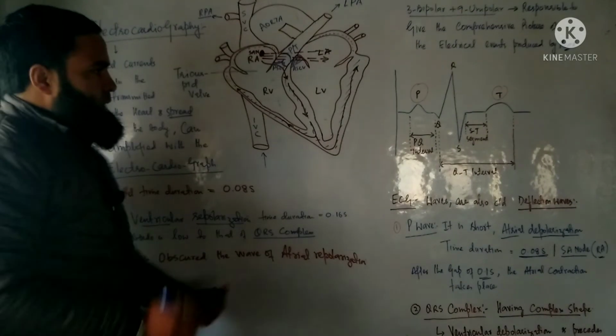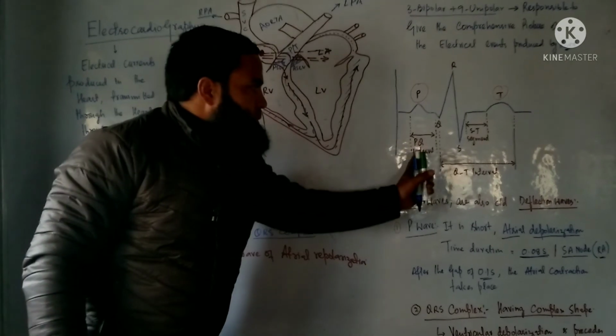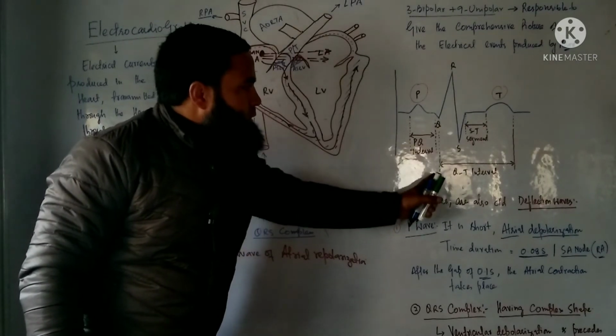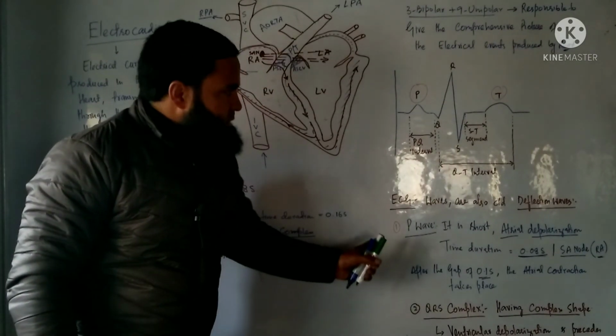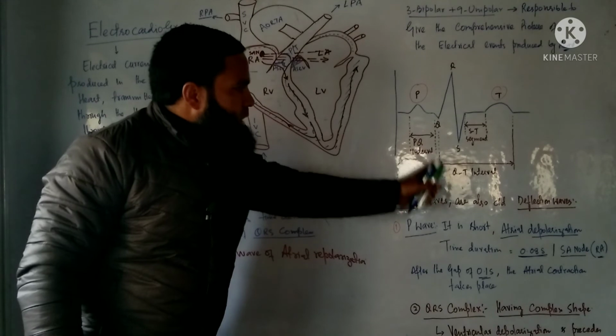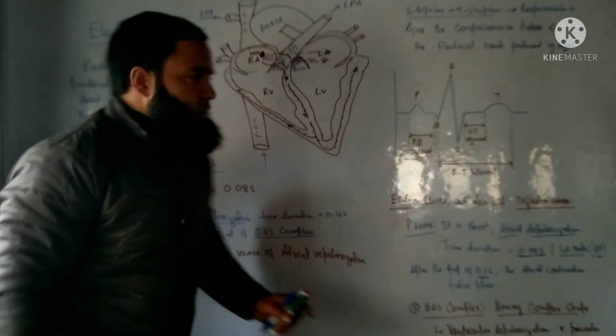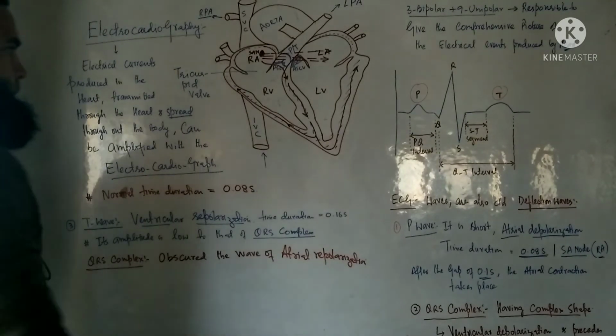Another point. There are certain intervals in the form of the PQ interval, which is also called the PR interval sometimes. And then there is the ST segment and then the QT interval. What are these?